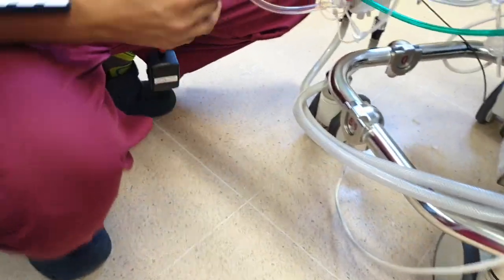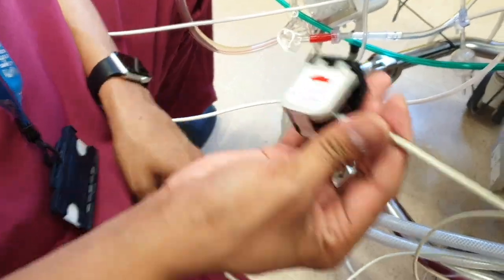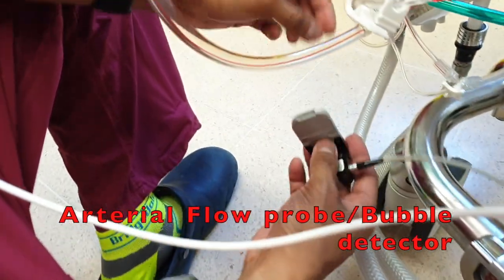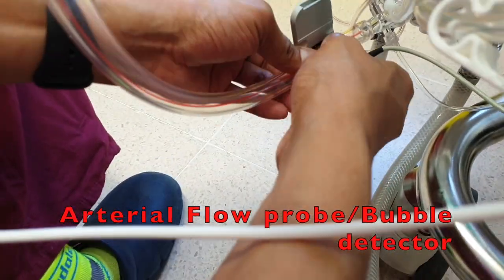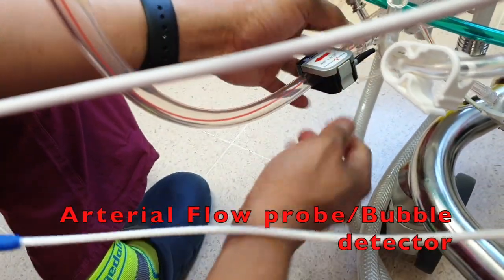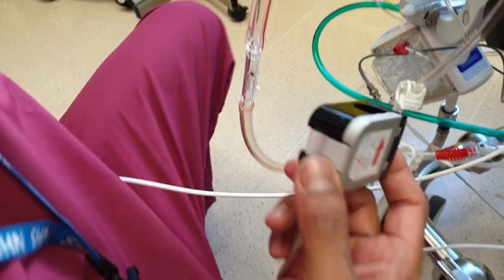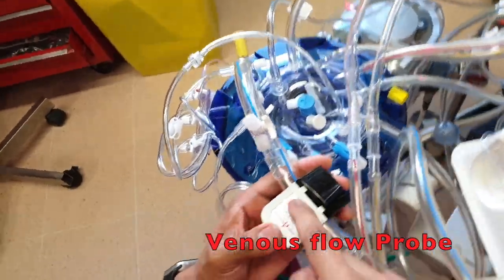So if you just tell me what is what. So we got arterial flow probe. That's a 3/8. So put it here on your out. At the same time, this one is your bubble sensor. So it's a flow probe and bubble sensor. So we just put it near the out. And then the other probe is for the venous flow probe. This one, half. Just mind the direction.